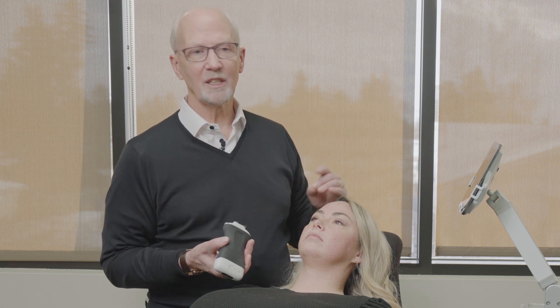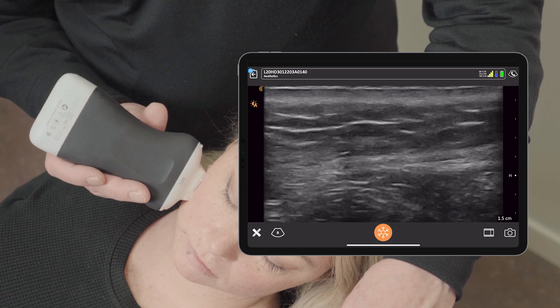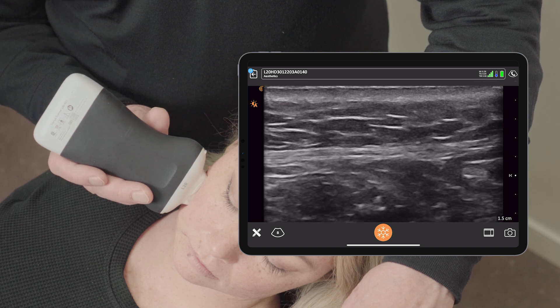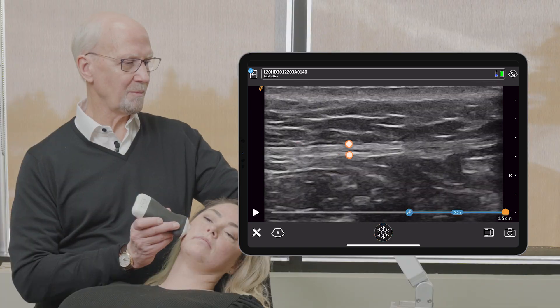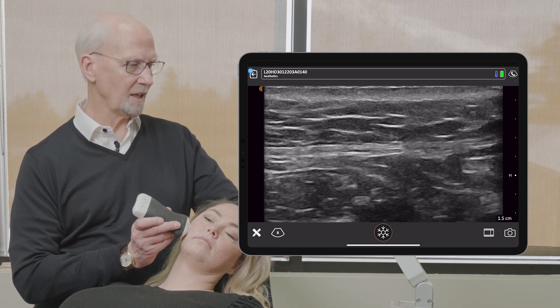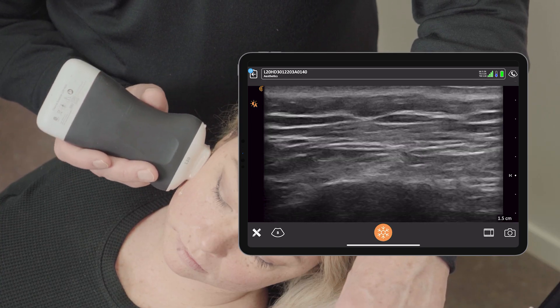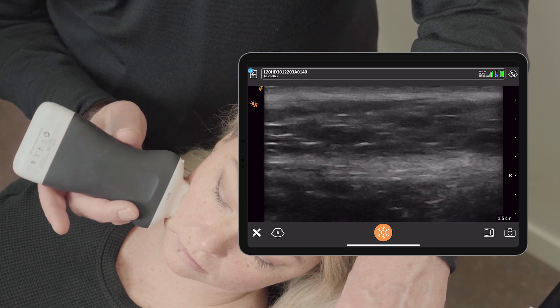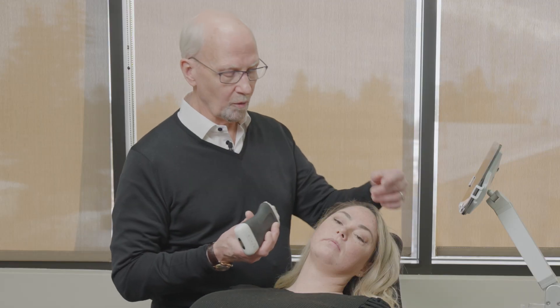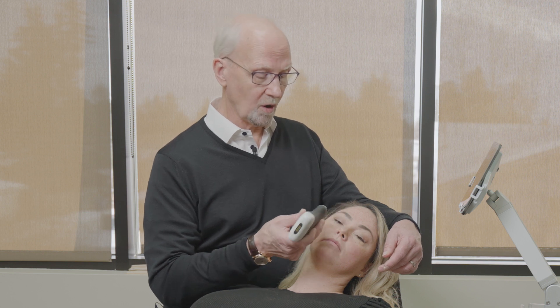One area that's important and very helpful to use as a landmark is to find the zygomaticus major muscle. The zygomaticus major muscle is the striated band going horizontally through the middle of our screen, and this originates in the zygomatic arch and extends down to and inserts into the modiolus. So that's the lateral aspect of the mid-face. The medial component we've gone over extensively as the nasolabial fold and the lateral wall of the nose.